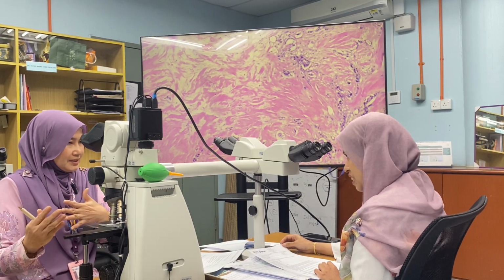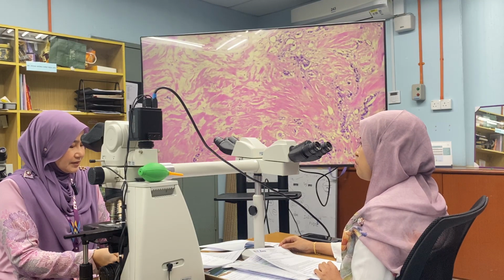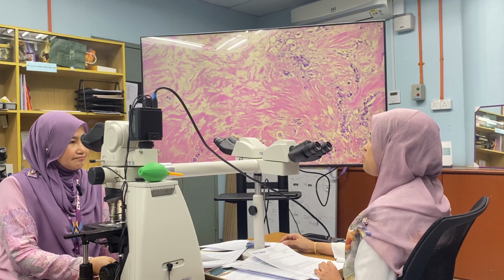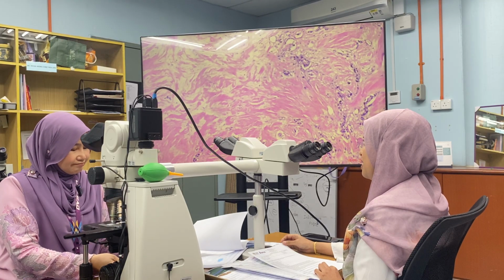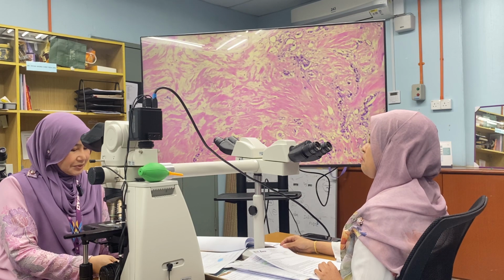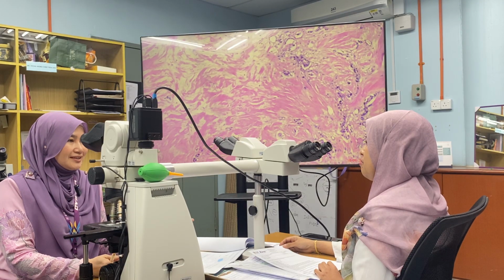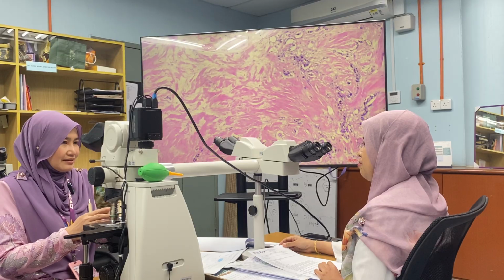Fibrosis maybe in gross, and then microscopic, we can see the fibrotic, and then the inflammation, histiocyte, and also the tumor cell necrosis. Yeah, all right. Chronic inflammation, and sometimes they can have a histiocytic reaction. There's a lot of histiocytes in that place, right?